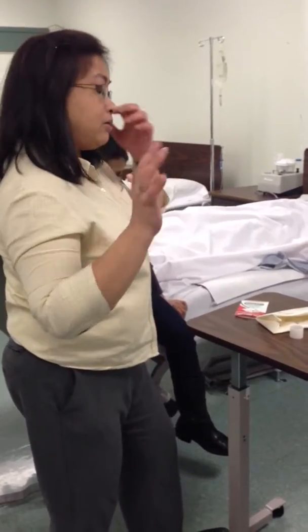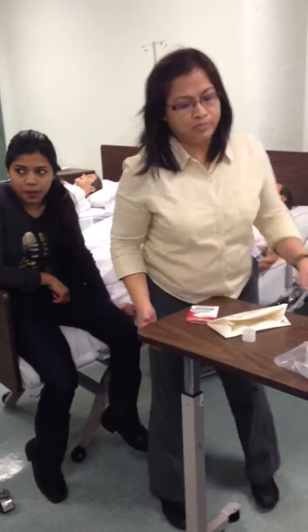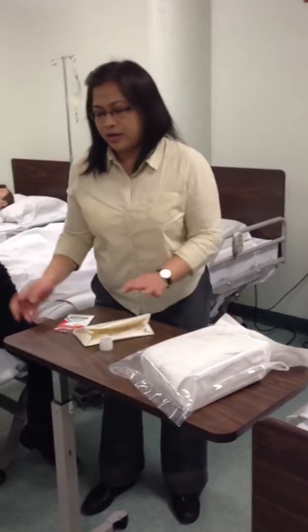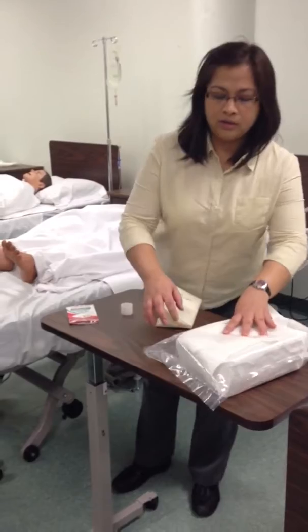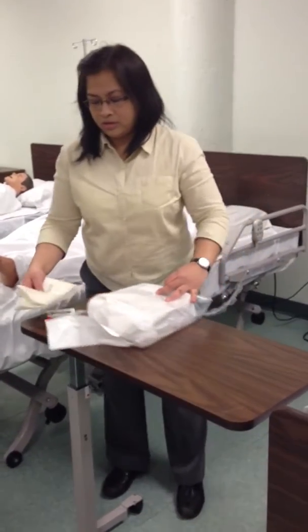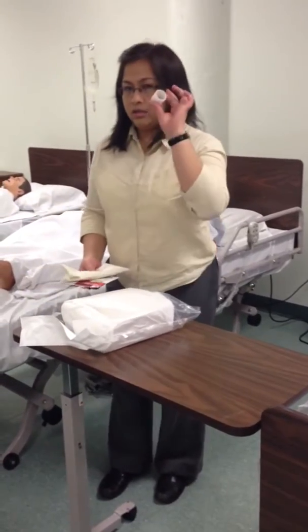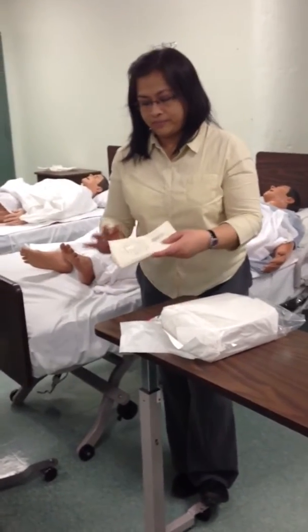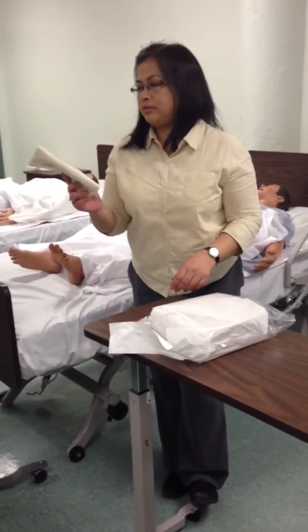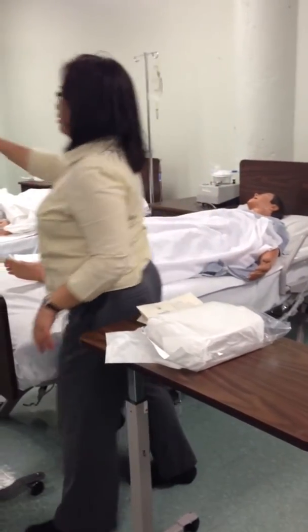Either you memorize that, or the name and date of birth, or write it on a piece of paper or a notebook. So you gather, you wash your hands, you gather your supplies. You have the kit, the tape, the securing device, the sterile gloves, and also we need one extra: clean gloves. It can be a box of gloves.